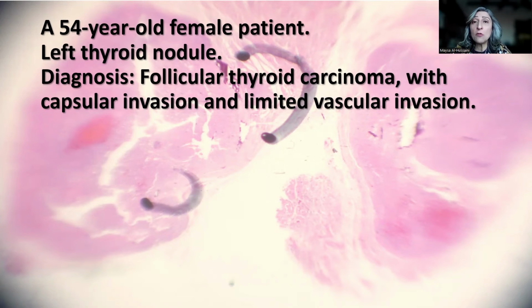Remember that capsular invasion does not have to be mushroom. Sometimes it can be a finger-like projection, but it has to penetrate throughout the whole thickness of the thick fibrous capsule. Occasionally, you can see the formation of a new pseudofibrous capsule at the advancing edge. This does not negate the diagnosis. You have to remember the diagram that I just shared with you and the imaginary line that you can draw at the outer aspect of the fibrous capsule. And if the nodule penetrates beyond the outer aspect of the fibrous capsule, this is also supportive that there is capsular invasion.